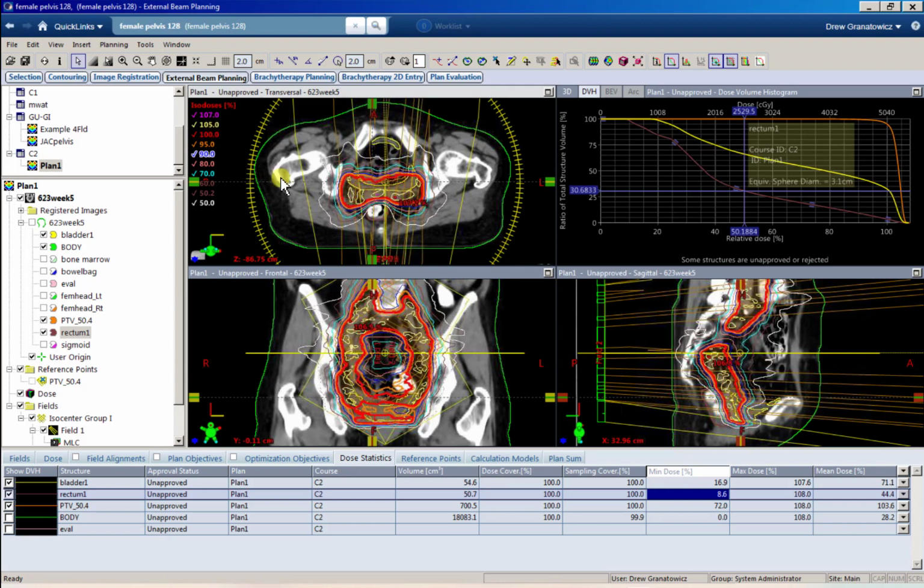All right, so I'm going to give you guys some constraints to work on based on this plan that I just ran right now. So the constraints I give you are going to be based on this plan we just ran in this class. So all the constraints will be very possible to meet. All right, other than that, if you have any questions, please reach out.